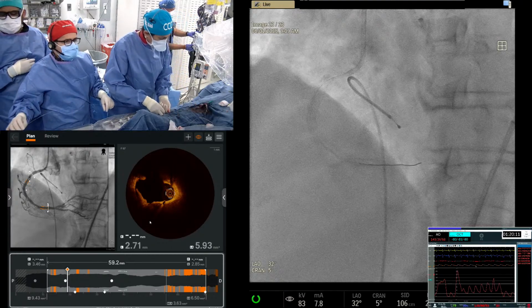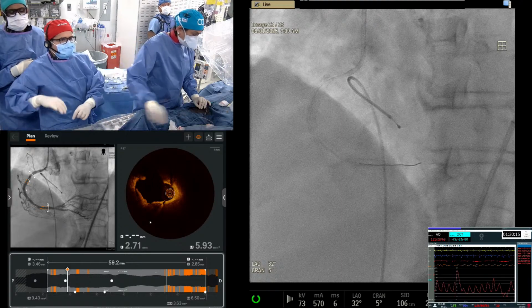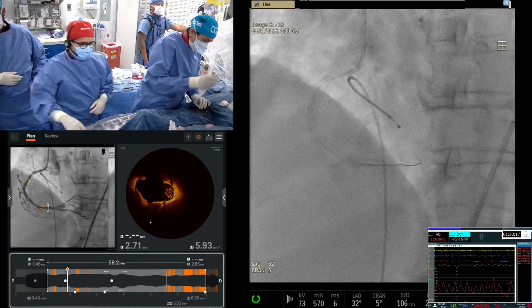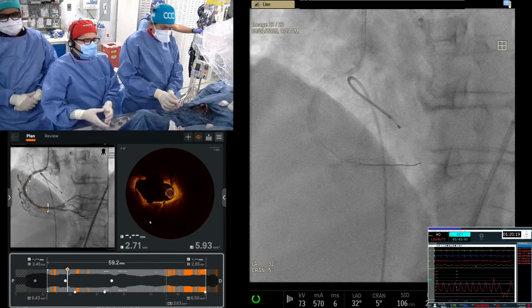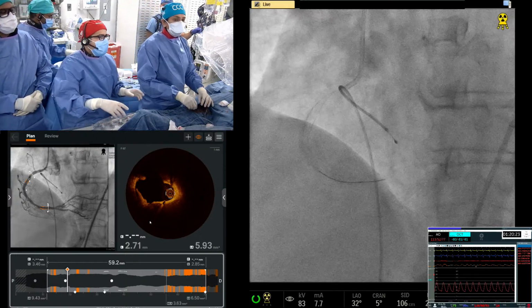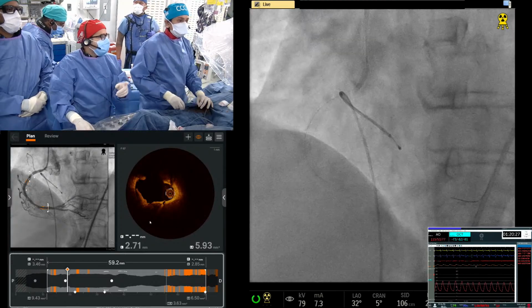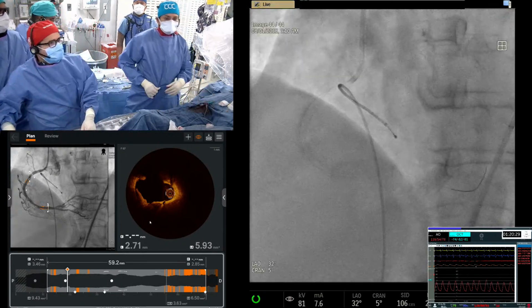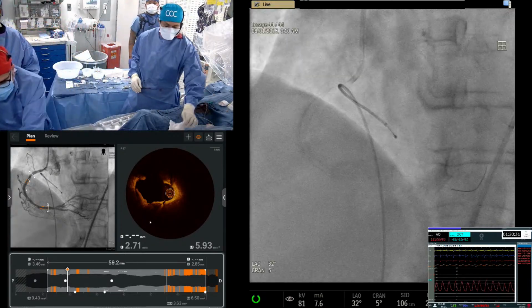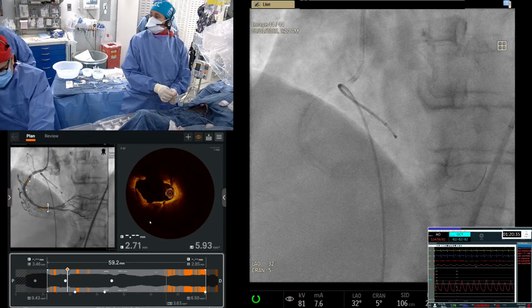And I think with the imaging, the balloon size 1:1, low pressure. Because you don't want to go small balloon, big pressure, and again cause more dissection. And another point from the OCT point of view, if you see the medial dissection, we call it a major dissection, so we should cover it with a new stent. So intimal dissection or medial dissection, we can check by the OCT.